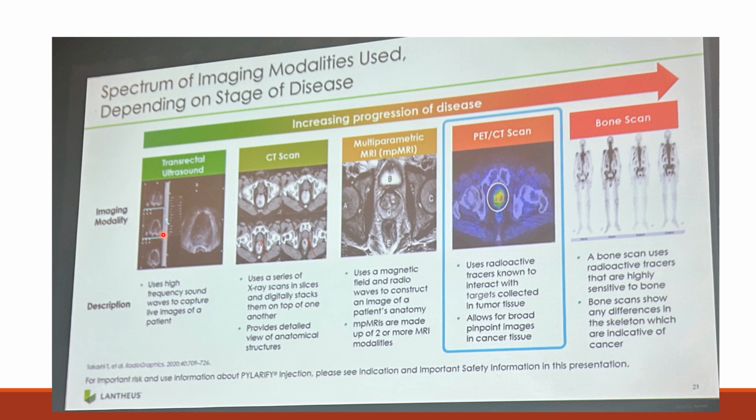Once we know it's cancer, though, nuclear medicine is really the best because we're seeing functional stuff. So PET CT scan, that's where we can do PSMA and FDG and Axumin, right? We also have fluciclovine. There's also like C11 choline. I'm not talking about that because it's not really on your boards, but it is FDA approved. Super short half-life. It's only going to be used in research facilities because the half-life makes it too difficult to really manufacture or use. So we have fluciclovine, we have FDG, and we have PSMA in our prostate scan arsenal.